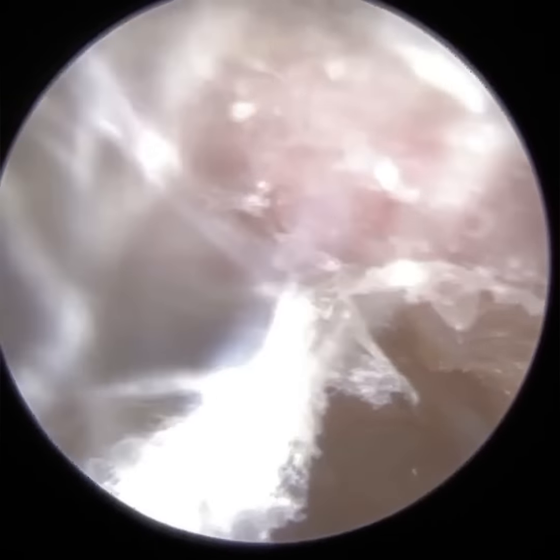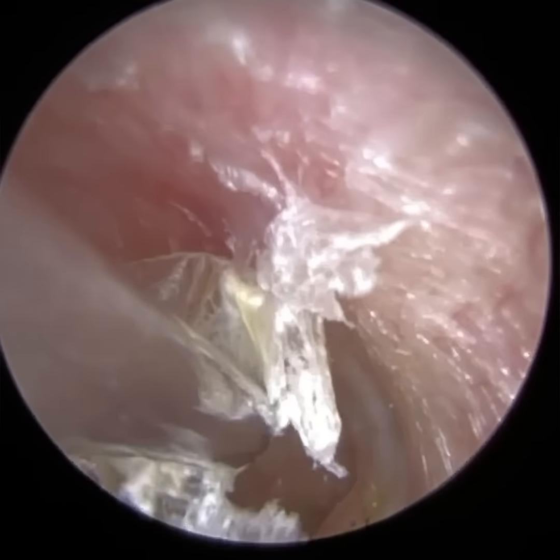You can just see how rough this is. It's like sandpaper. And you can see some skin there just curving into the back part of the eardrum itself, where the hole is. So I'm just leveraging this down.